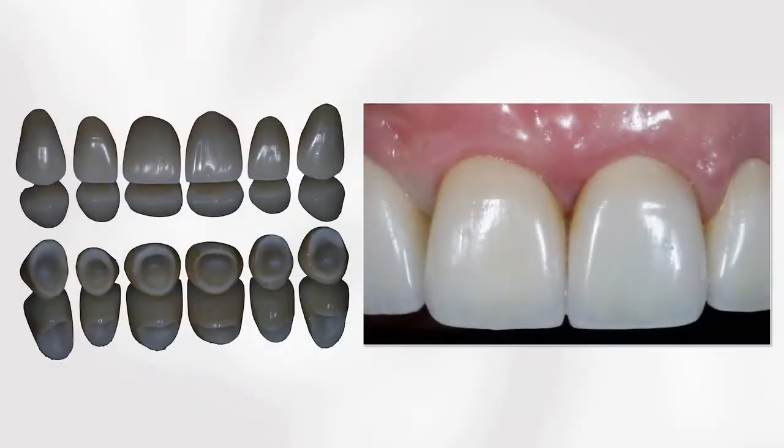The final crowns were made. It was cemented over this customized abutment of the implant and the natural teeth. And here you can see the balance between the gingival margin and the papillary height position.